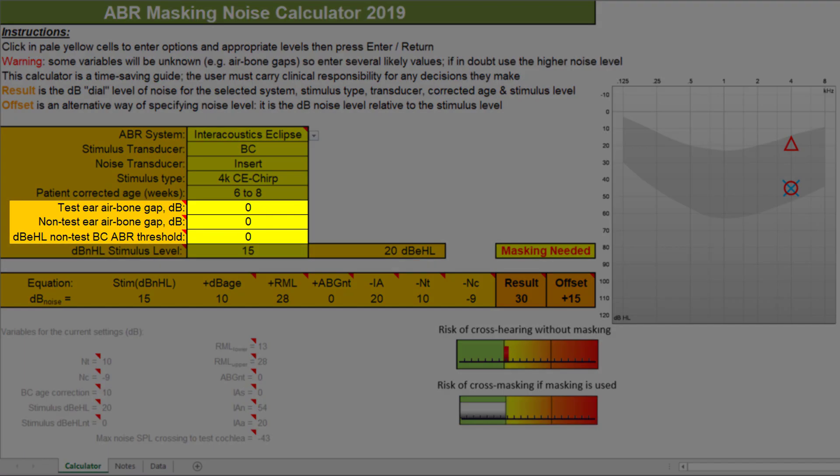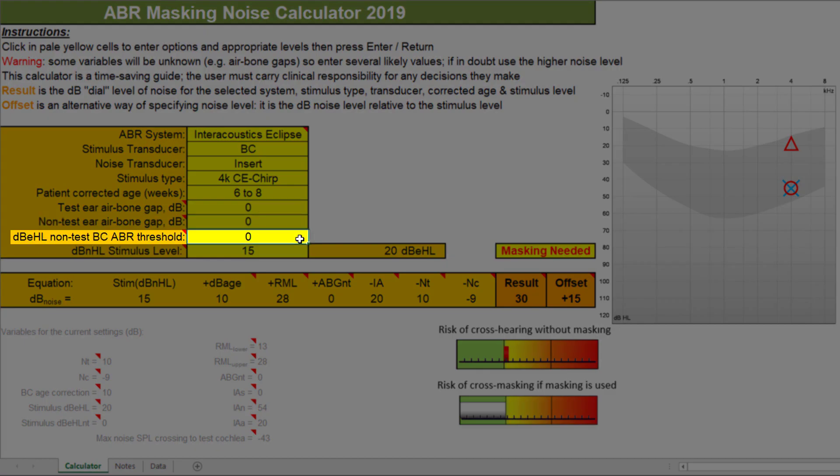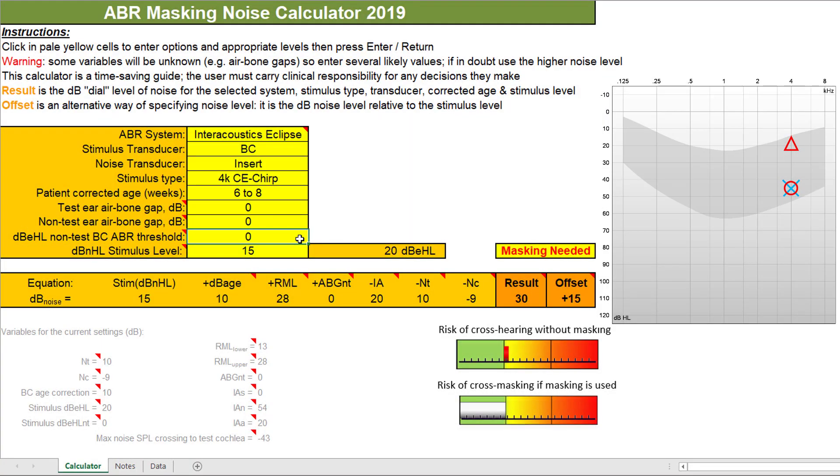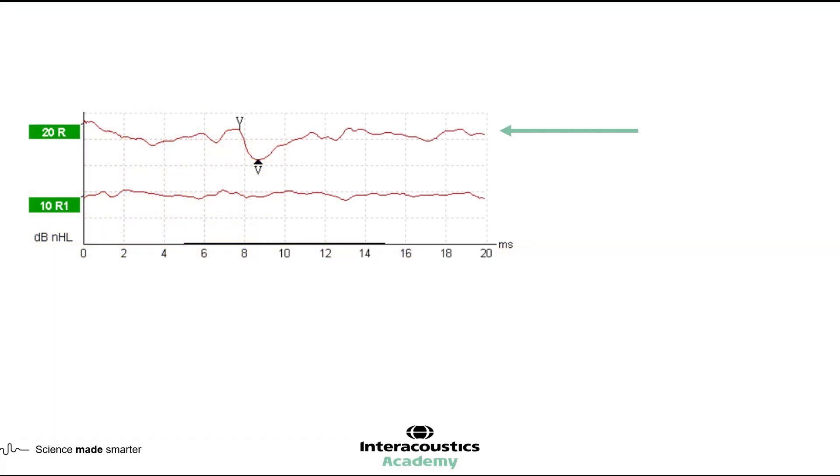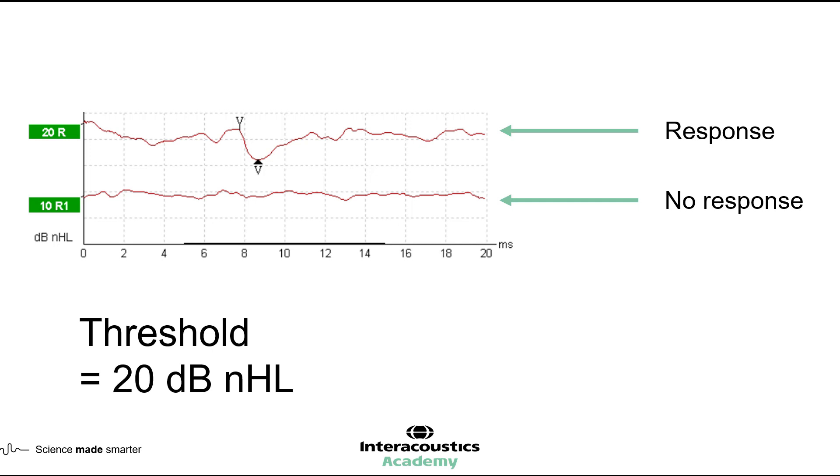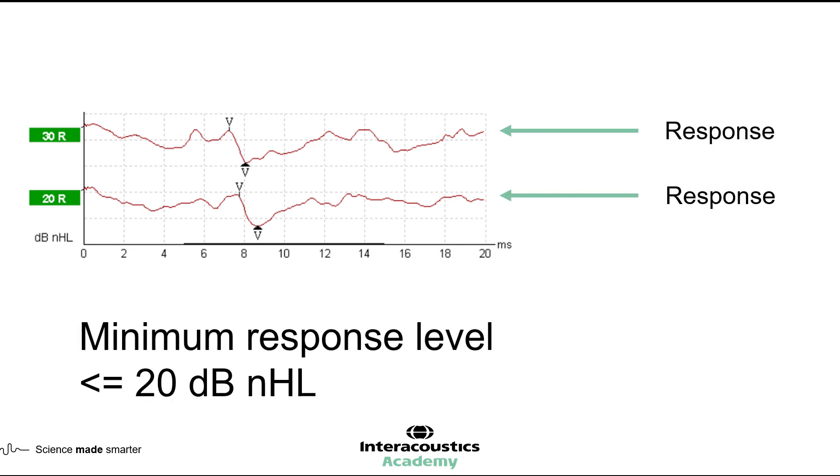Now, there are three remaining boxes to complete in the calculator. The test year air bone gap only applies for air conduction masking, so we can leave this as zero for this example. The non-test ear air bone gap and the non-test BC ABR threshold are both unknown values at this moment. You can make use of your not masked bone conduction response to guide you at this point, if you have recorded a threshold. This will be the lowest possible bone conduction value for either ear, so you can use this to estimate the value for these two boxes. If you have only recorded a minimum response level as opposed to a threshold, then you must be aware that the true bone conduction threshold may be much quieter, leading to greater amounts of masking being required.